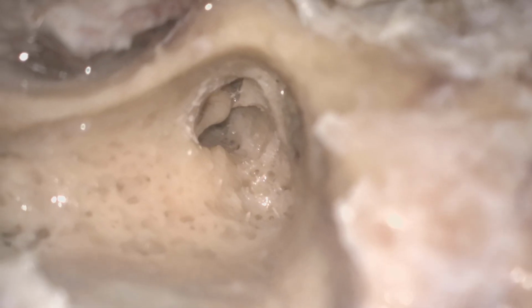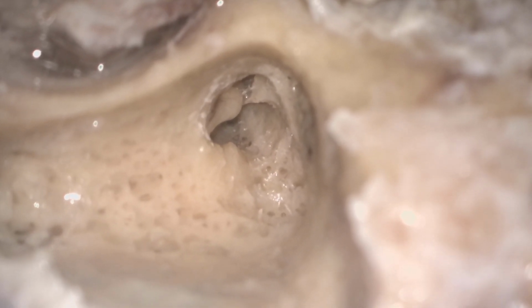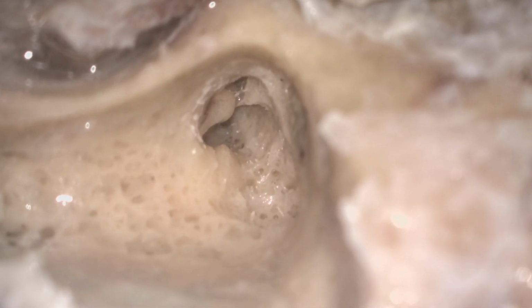Just make your head slightly lateral so that you can visualize properly, and then go for anterior. We have just started visualizing the IM joint, just anterior to that. Some water.